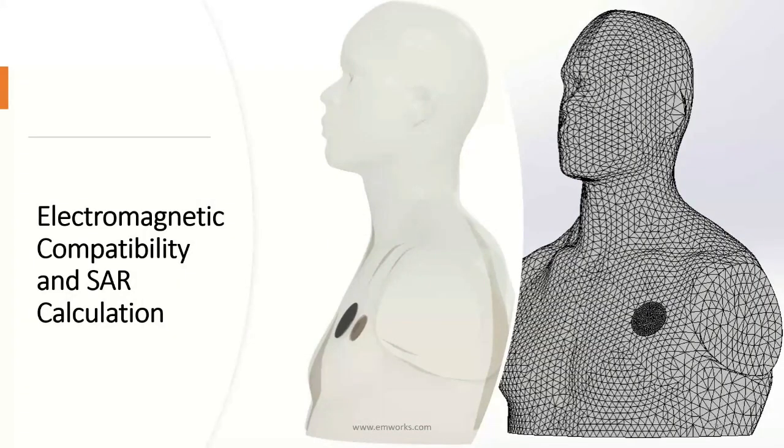Now we're going to have an idea about electromagnetic compatibility and specific absorption rate. For implanted and wearable medical devices like pacemakers, and also wearable devices like phones, the electromagnetic radiation should be limited as much as possible and not exceed the EMC standards limits established by international healthcare organizations. Therefore, we have simulated the wireless charger system in realistic conditions. We have used a human body where we have put the receiver. Both the transmitter and the receiver operate at the resonance to have maximum transferred power.